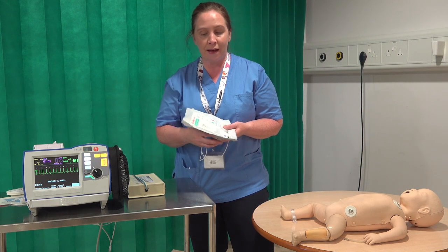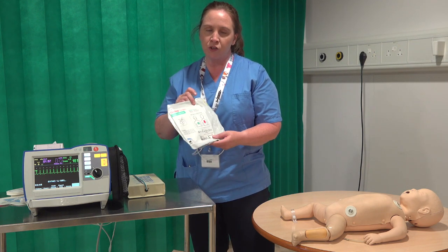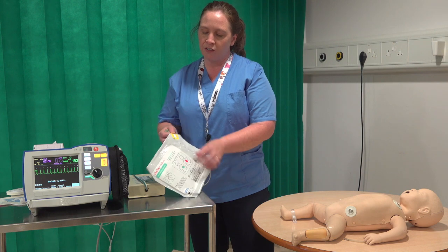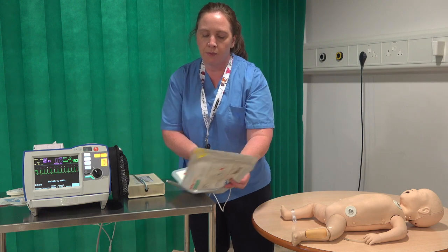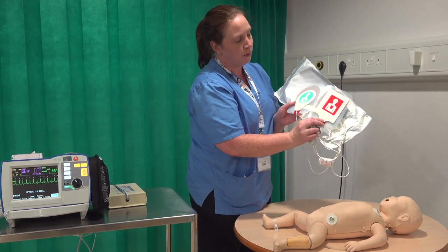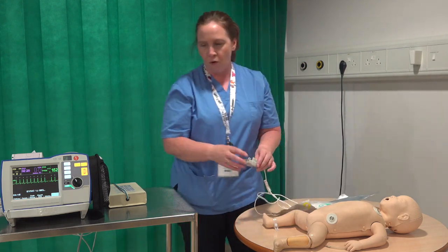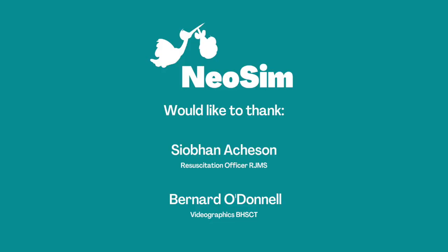We also have paediatric pads — they attach up just like the adult pads do. Paediatric pads are used from birth up to age eight; from eight and above you would use adult pads. There's a yellow sticker on the pack — pull that apart and you'll have your two sets of pads inside, pre-attached. There are pictures on the pads telling you where they need to go: the blue one goes on the front of the chest and the other goes on the back, so your AP position. In areas that look after children, these pads will be pre-connected and ready to go.